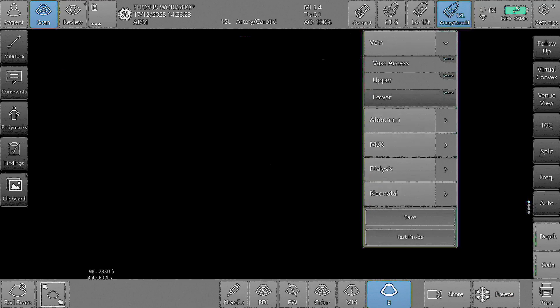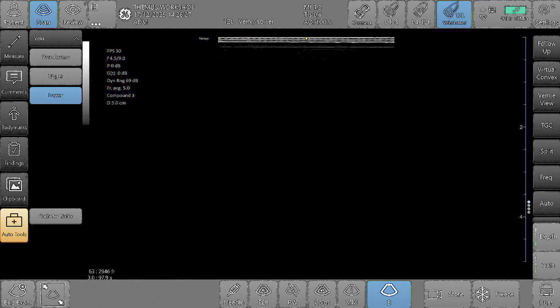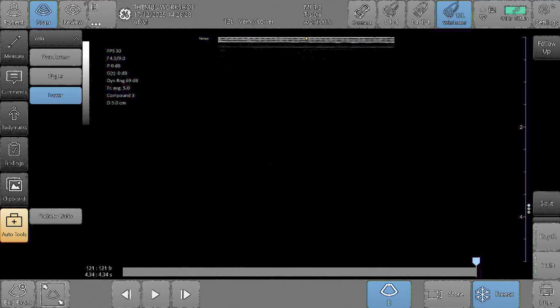But if the patient is on positive ventilation and you can give paralysis medications, in that case, I think that will be easier to analyze the rest of the things, right? Does it mean in the positive pressure setting, repeat like this? Yes, the same. Yes.